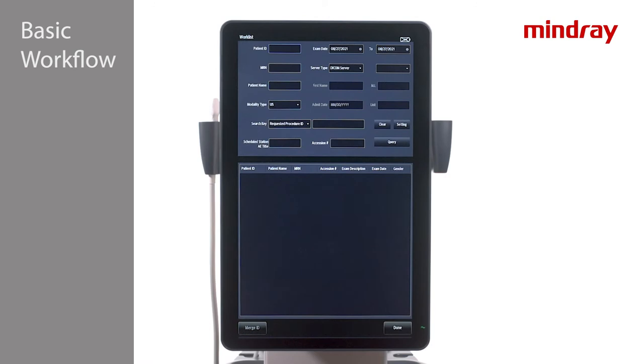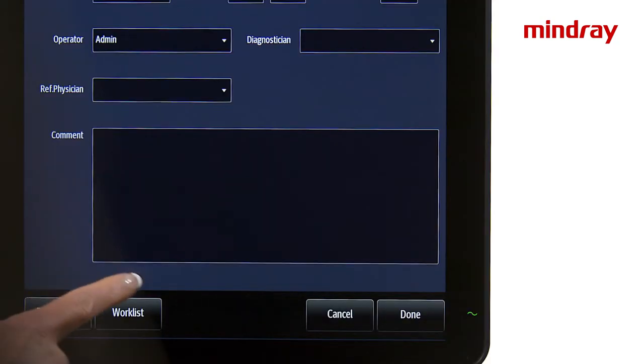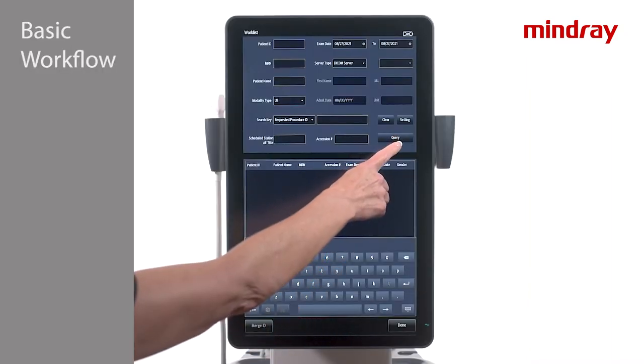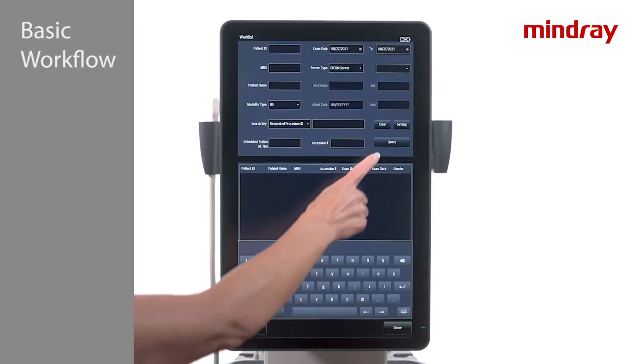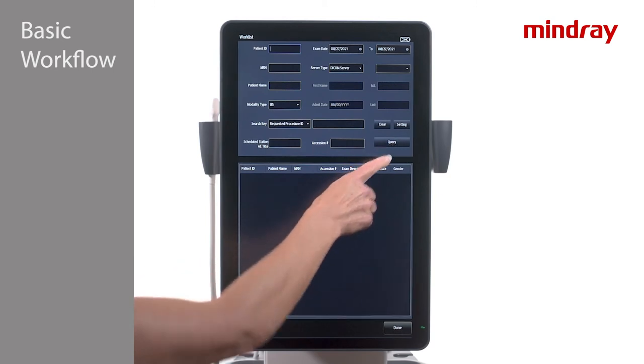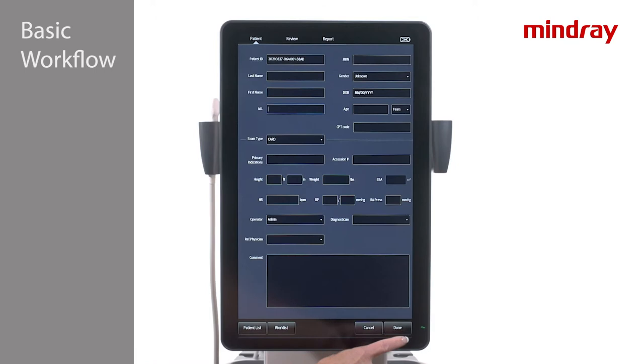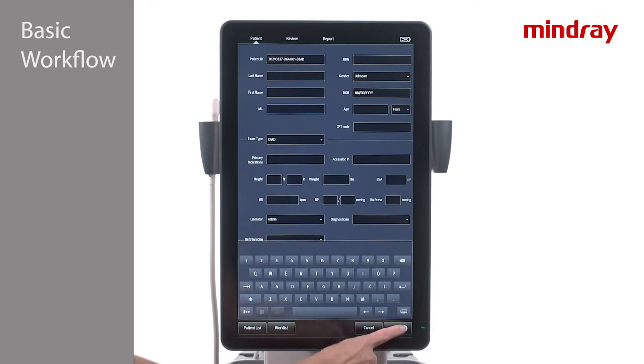If this tab is grayed out, it is because you are still in an active exam. Tap Worklist and Query. A list of patients will appear to choose from, or input search parameters at the top of the page. Choose the desired patient and press Done when all information has been entered into the demographic page.